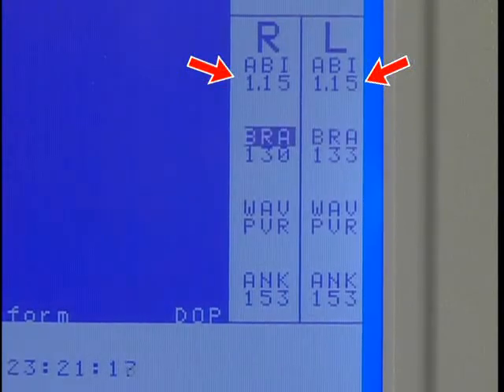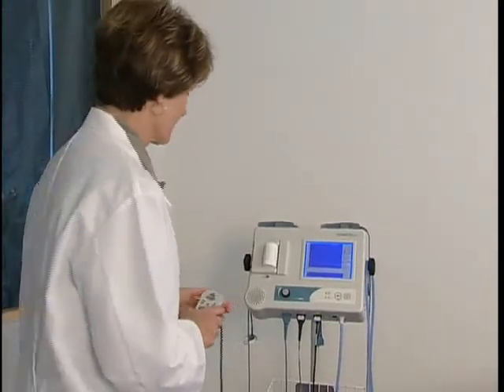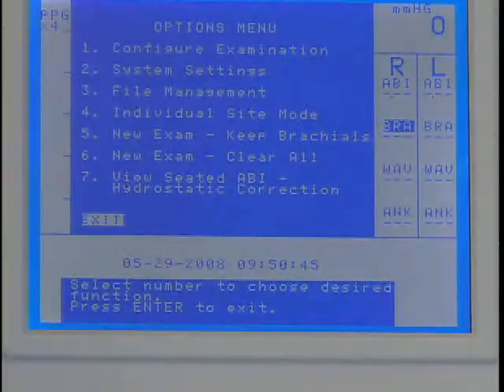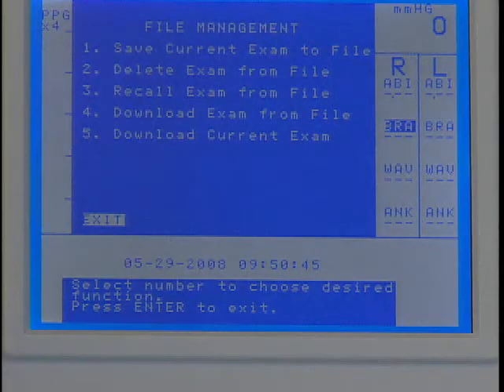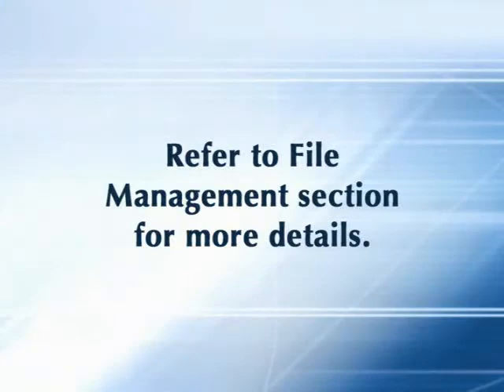At the end of the exam, the ABI results are calculated automatically. After completing the exam, press Print and apply the adhesive-backed labels with the exam results onto the report form, or save the exam to one of the 10 storage locations as explained in the file management section of this video.